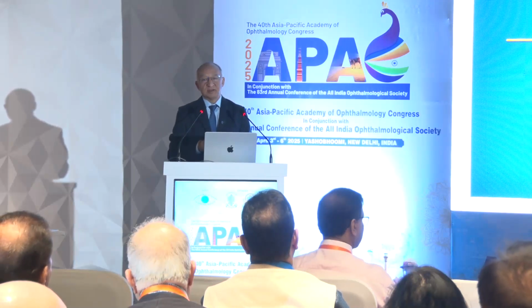I think it's a good concept to have a pinhole so that all the unfiltered light is not there. You have parallel light going to the fovea and you can see better. Pinhole IOL is a good concept because you can still dilate and assess the peripheral area, but these lenses are not available per se and never became popular, like our presbyopic correction. Thank you, Professor Namrata, for giving these very important tips.